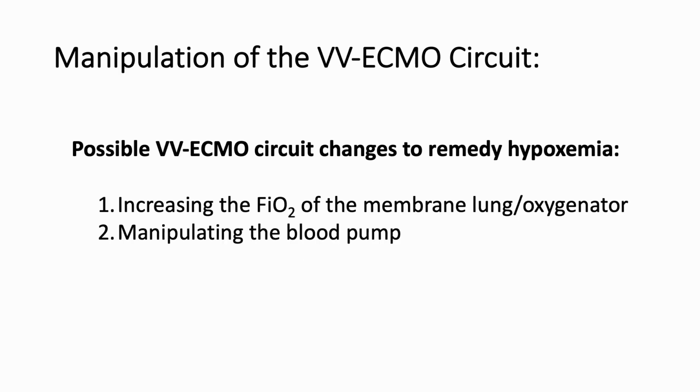We'll start with our options for manipulating the VV-ECMO circuit. Essentially, there are two main changes that we can make, and these include increasing the FiO2 of the membrane lung or oxygenator, or manipulation of the blood pump.